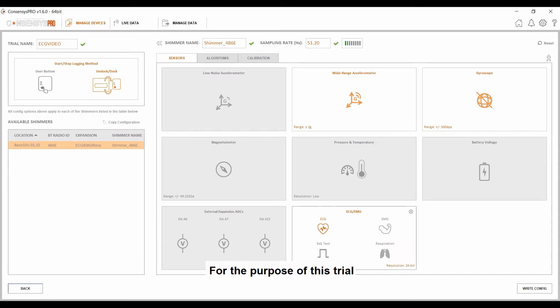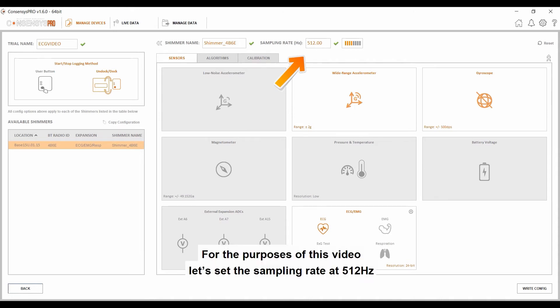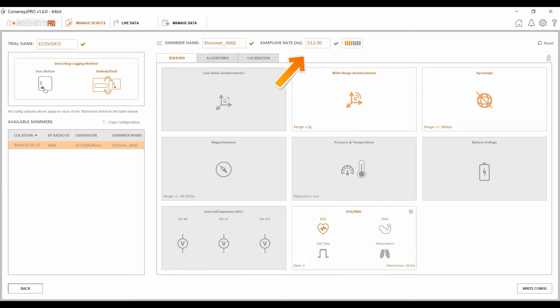For the purpose of this trial, I'm going to use the wide range accelerometer, gyroscope, and ECG. The sampling rate can also be set at this point, from a minimum of 1 Hz to a maximum of 2048 Hz. For the purposes of this video, let's set the sampling rate at 512 Hz. This is the recommended sampling rate for clinical grade ECG data acquisition. This is done by inputting into the box and pressing enter.